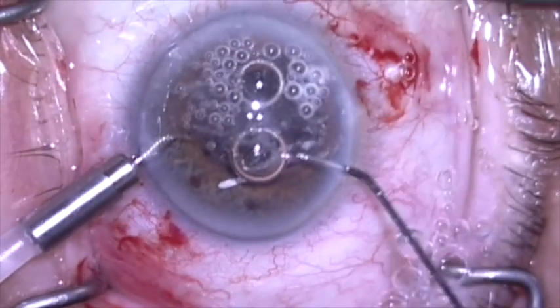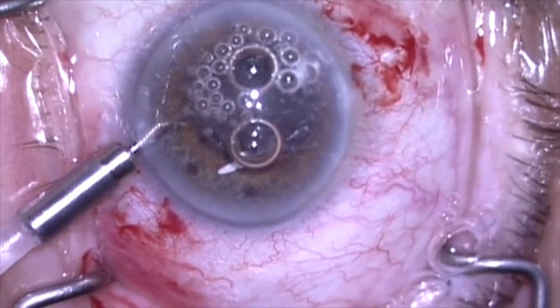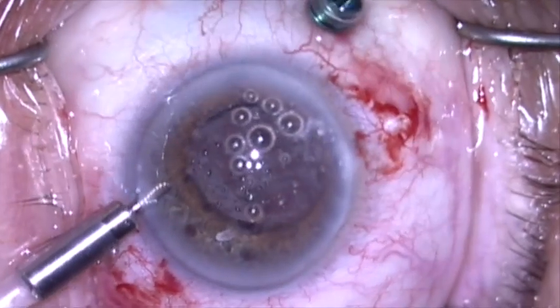We'll now stain with triamcinolone to see if there's any remaining vitreous present. After placing the triamcinolone and flushing with a little BSS, I'll go back and do a little bit more pars plana vitrectomy.